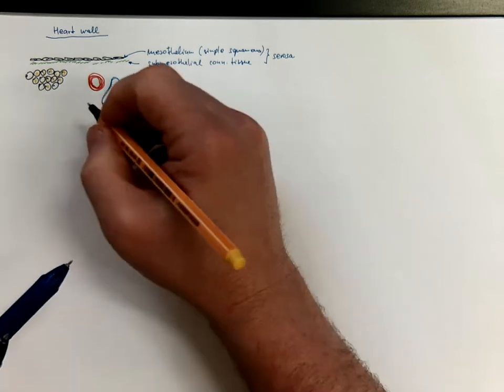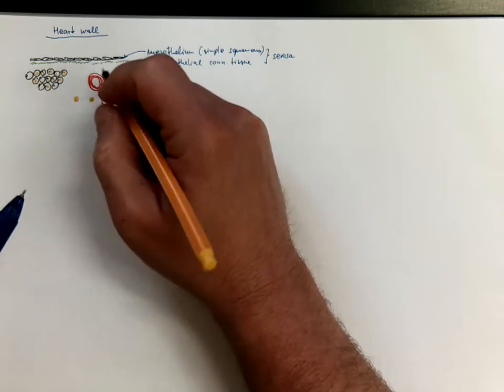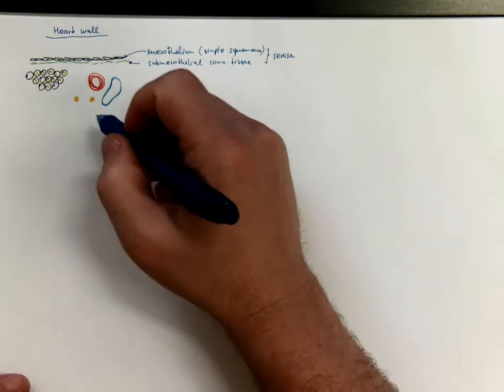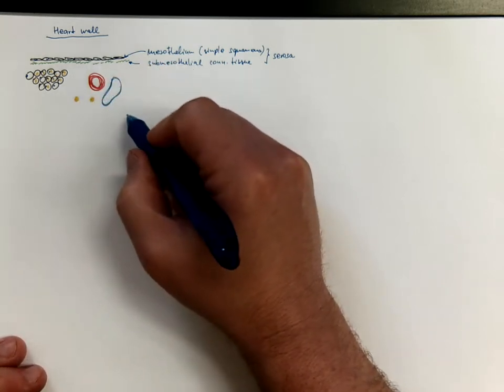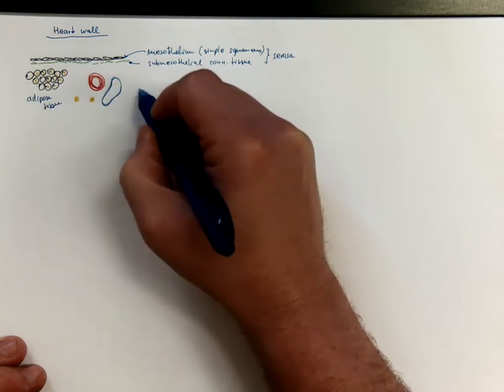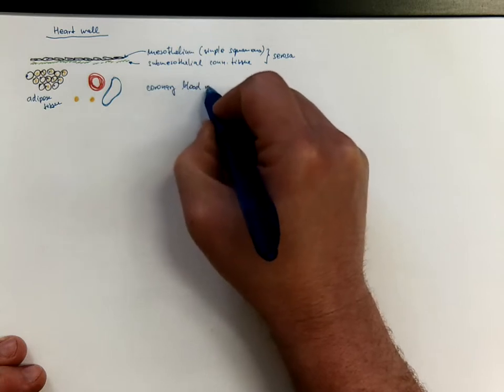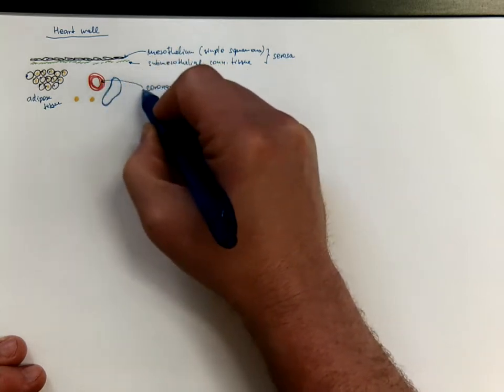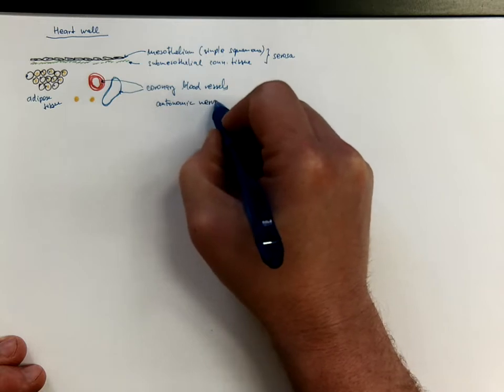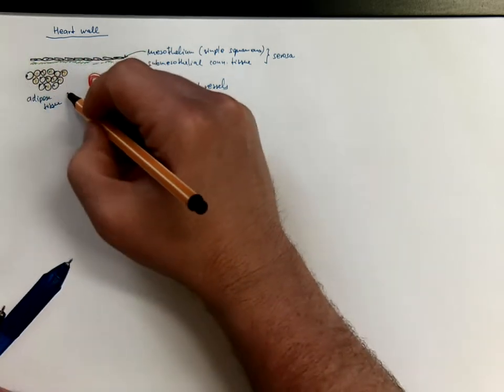We can find autonomic nerves there that are regulating and affecting the heart rate and the strength of the muscle, heart muscle contraction, etc. So there is adipose tissue, major coronary blood vessels, autonomic nerves, everywhere here is usually adipose tissue.